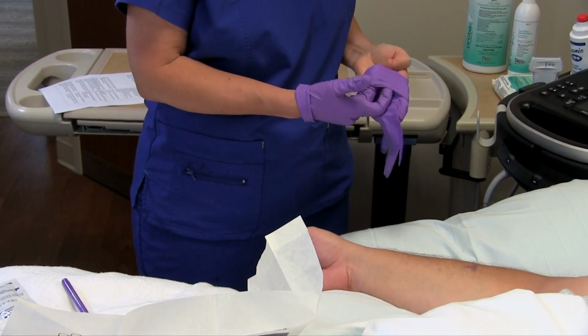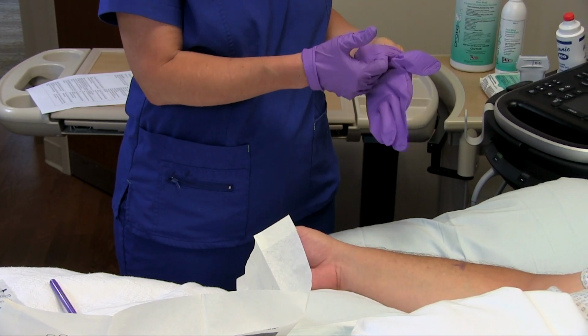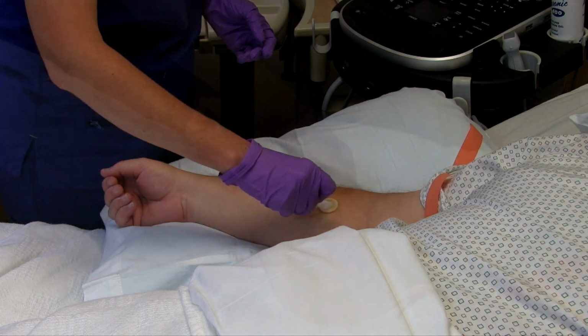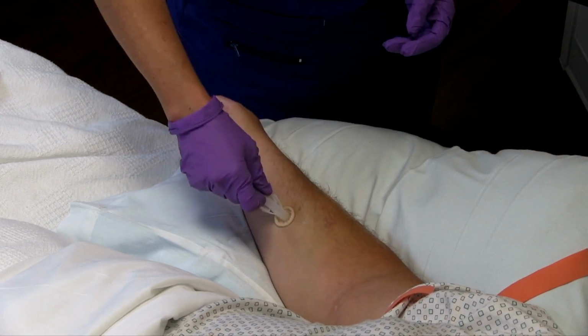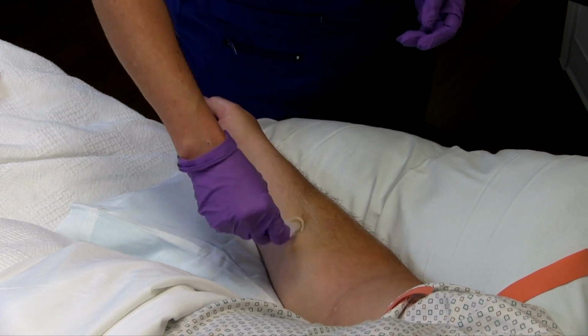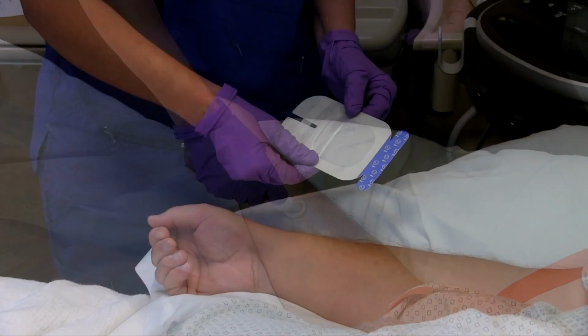Prepare for your aseptic technique and change gloves. Thoroughly disinfect the skin on and around the area selected for insertion. An alcohol-based skin disinfectant is recommended to provide rapid drying of the skin.